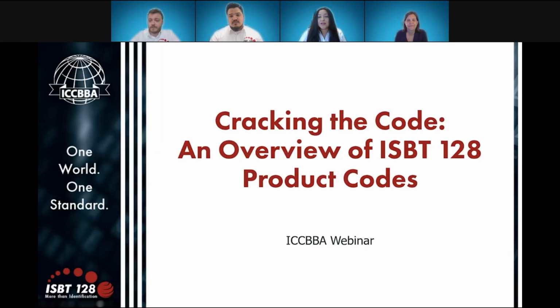Thank you. We have another question for Ryan. Is it necessary to include the collection type within the full product code data structure? That depends really on the MPHO type. Like I mentioned a second ago, for blood and cell therapy, yes, that 6th character identifying the type of collection is absolutely necessary.